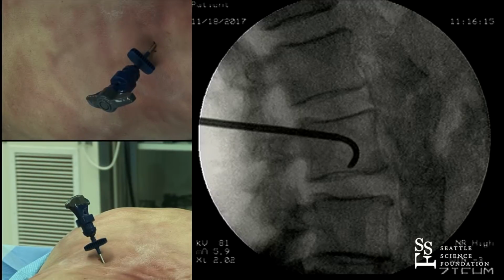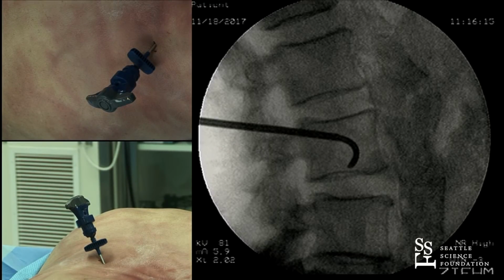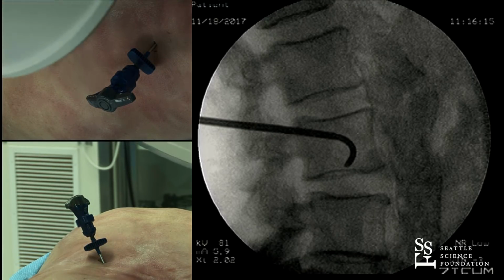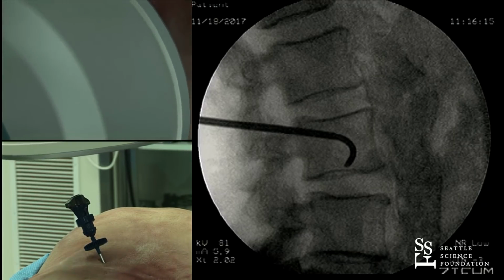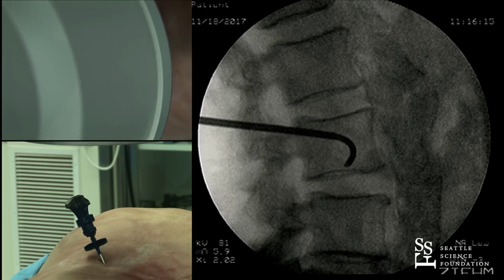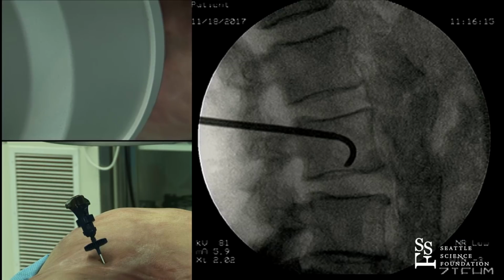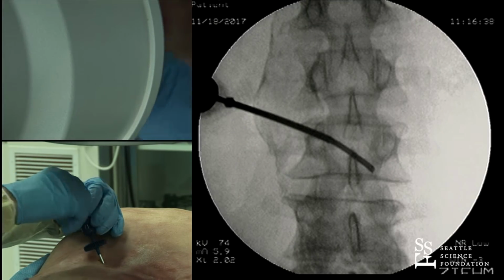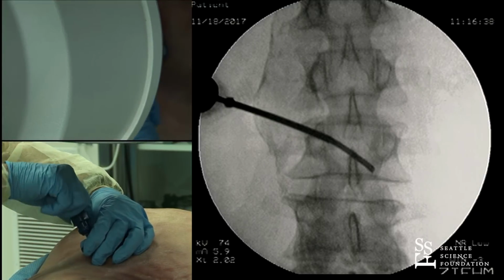So like that, we're hubbed. So we'll save that image, take it back around AP, and we'll see where we are. My guess is it will be a little bit past midline contralaterally, and this is going to be a relatively medial laterally placed balloon. We will place the balloon across that in the front part of the vertebral body, close to the midline, and we will blow that sucker up. I like that. I like it a lot. We'll take this out.